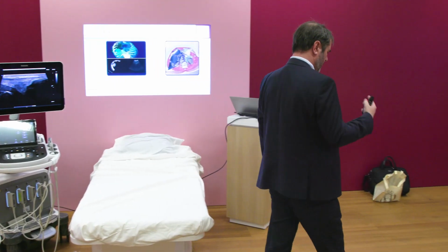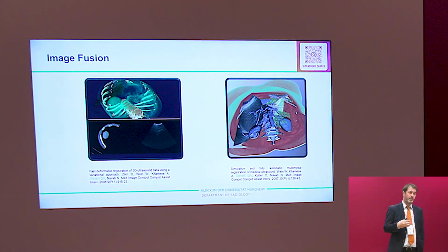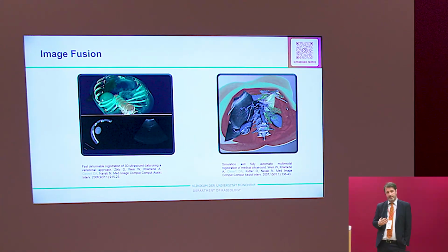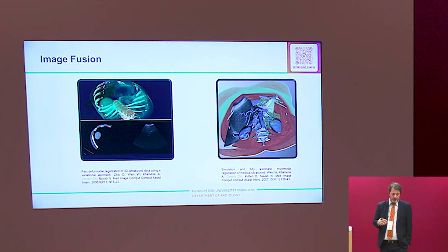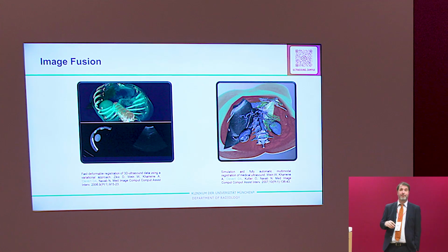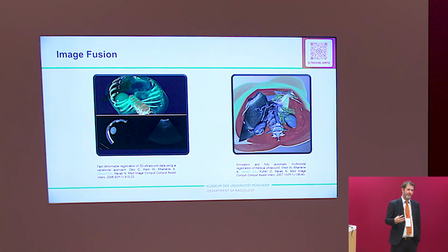When you ask me how long Fusion has been available, I can tell you quite a while. I had my first personal experience with Fusion in the year 2005. This is nearly 20 years ago. At this time, calibration of the system took 3 hours for a single patient. 3 hours. This was for research and not for a lot of patients.